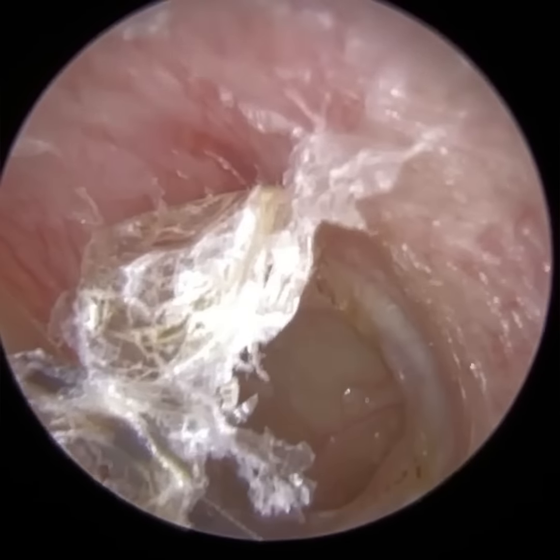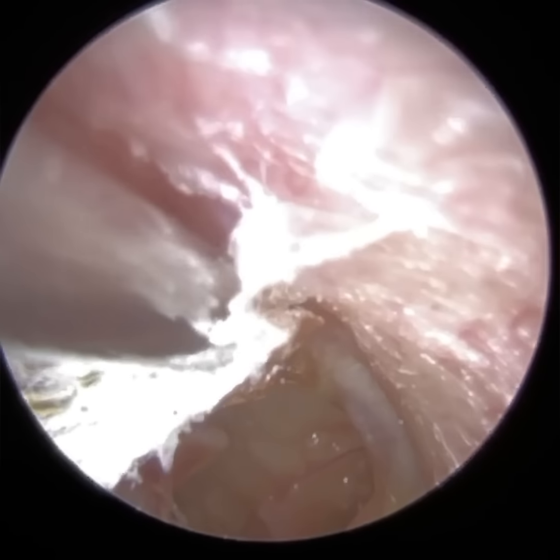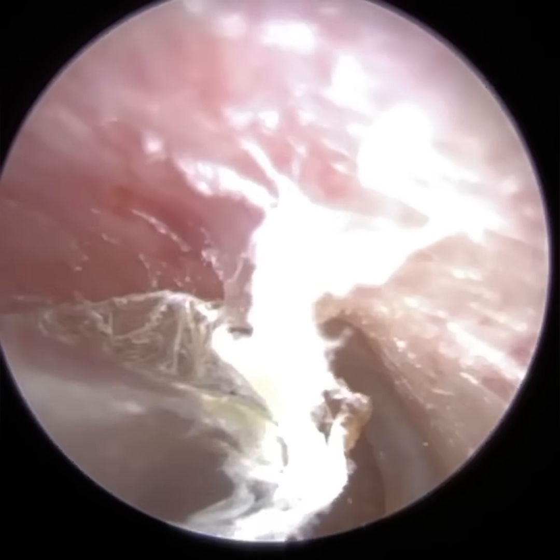I'm going to use the forceps, I think. It's difficult at this stage actually to use forceps, so just looking at the orientation of the skin, it's very difficult to get hold of it. So there's going to be an opportunity in a moment where I can get a better grip with the forceps because the skin is in a better position.